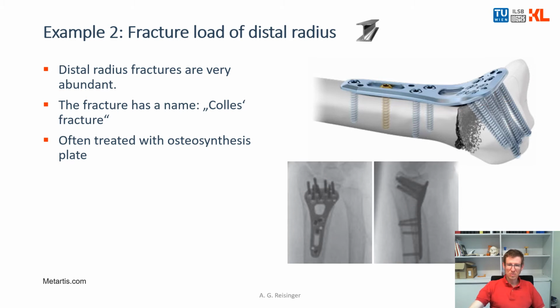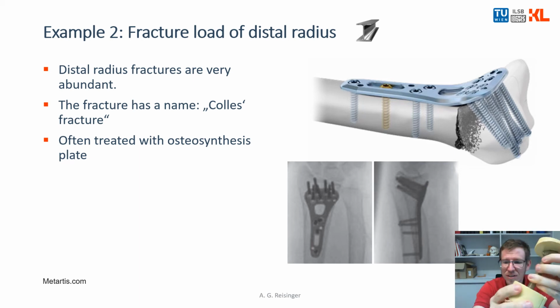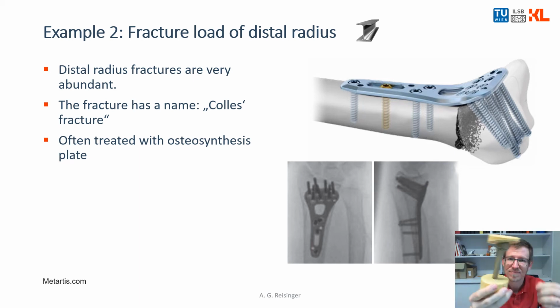There are many screws screwed in. I have a sample of that. Actually, yeah, this is it. Yeah, this is the actual plate screwed in. You see the fracture gap, screws sticking out a bit on that side. And this is how it is treated in the hospital.